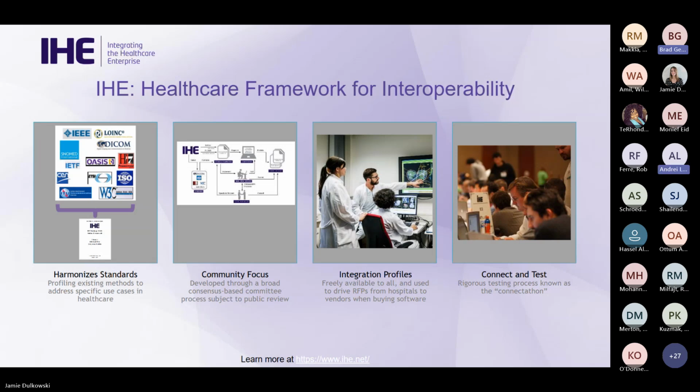So this is profiling standards like HL7, like DICOM, and all the other ontologies like RADLEX and LOINC, and pulling them together in service of the workflows that we see in hospitals, where it's super important that we have cross-application workflows. It is community focused, built by the community, supported and developed by both the vendor side as well as all of the physician communities and user communities, to help pull this together so it's useful for everybody.